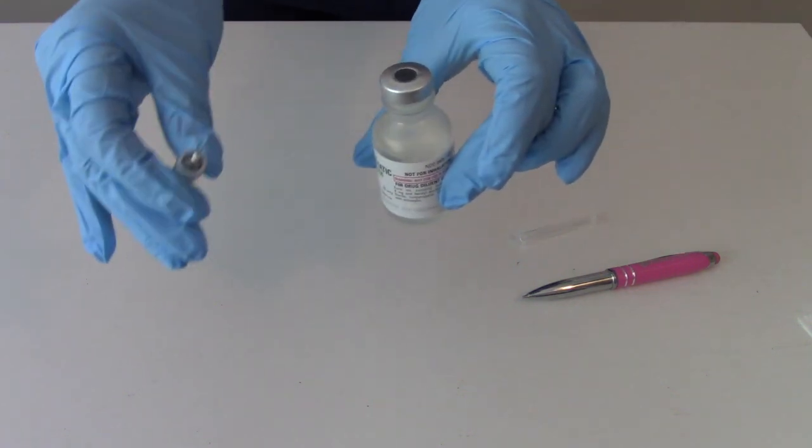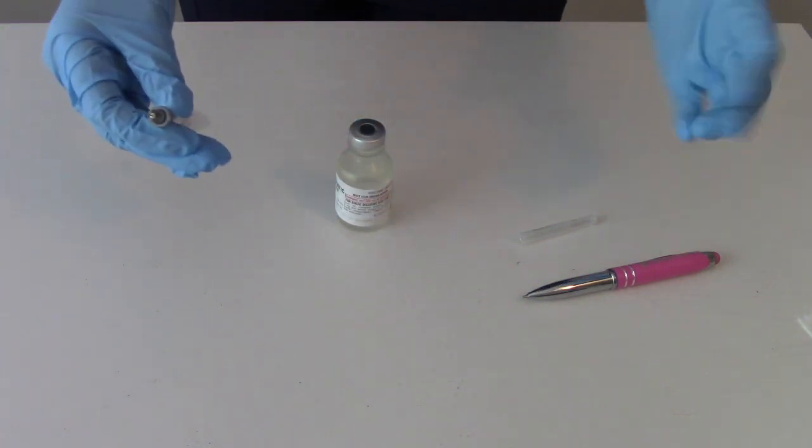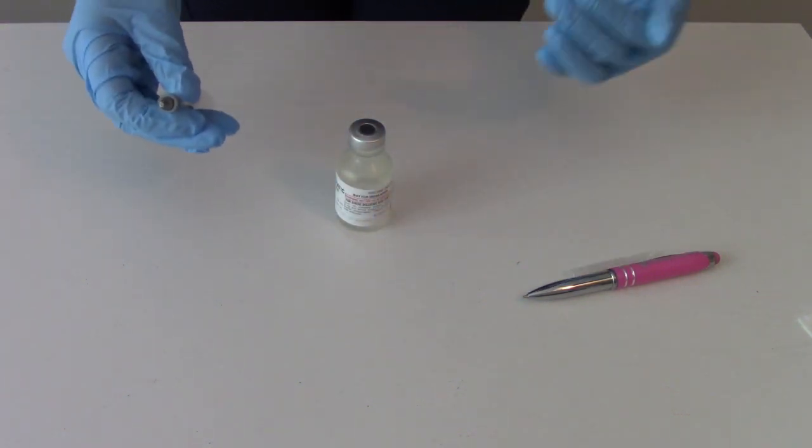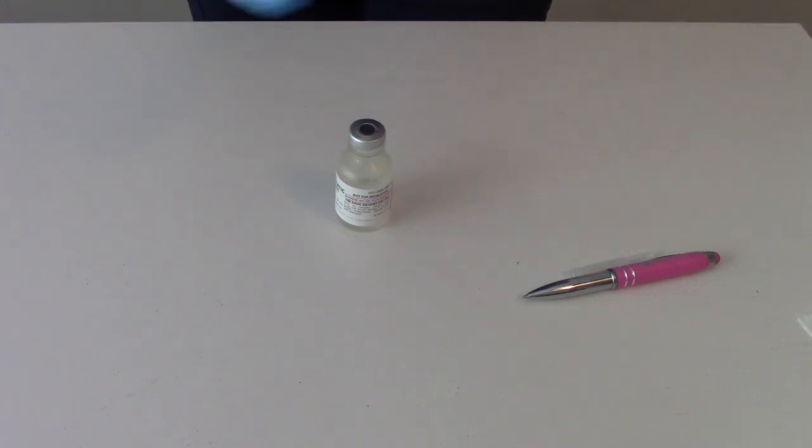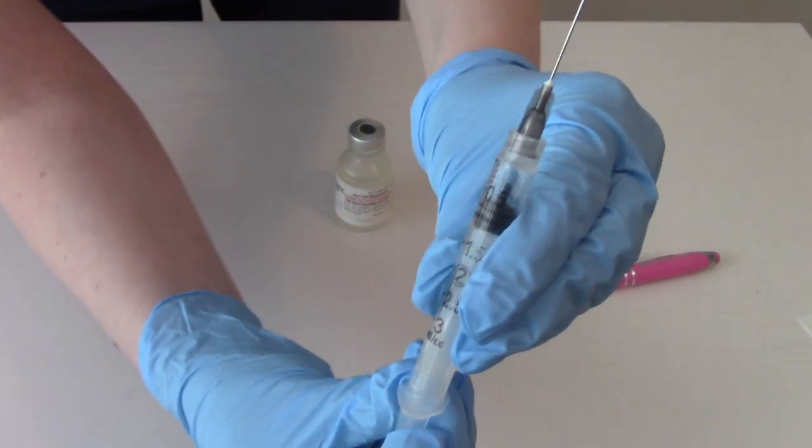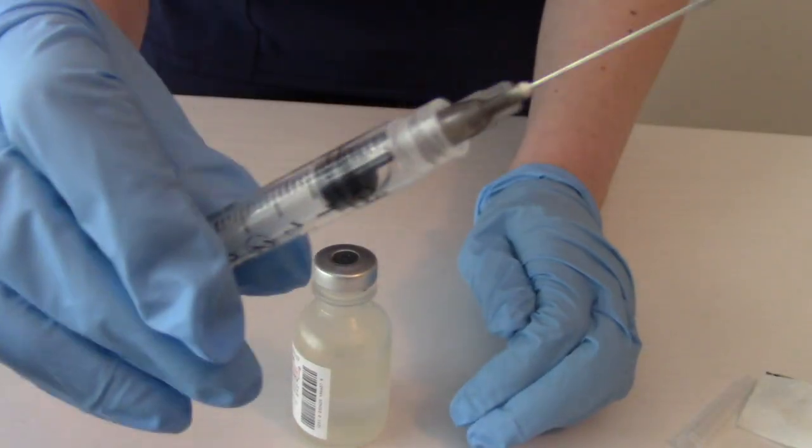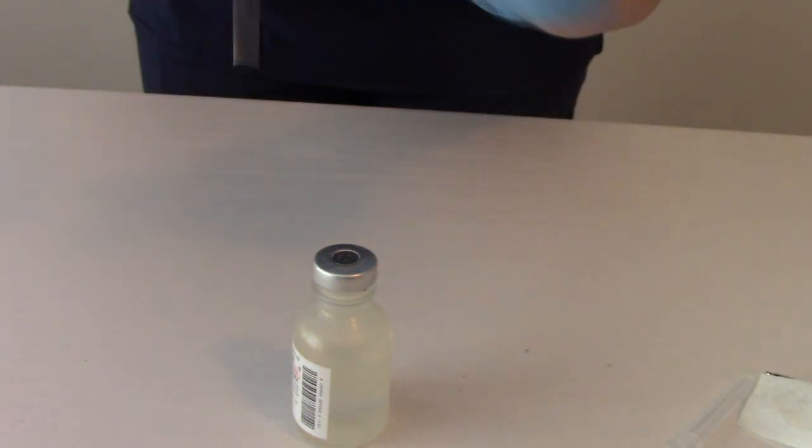Before we draw up from the vial, we need to instill air into the vial. Let's say that our medication record says we are giving 0.5 mLs. So we're going to draw back 0.5 mLs. Now we're ready to inject the air into the vial.